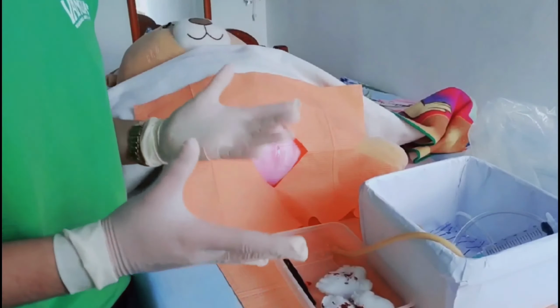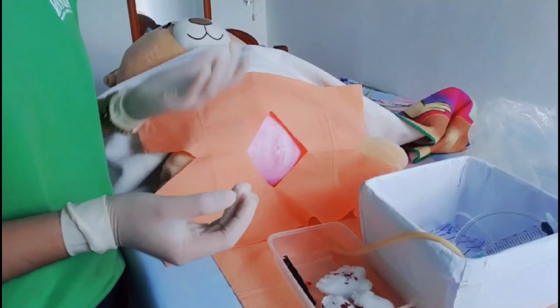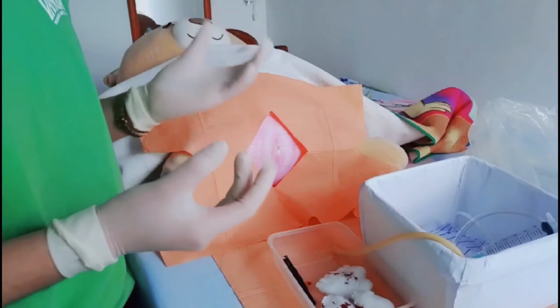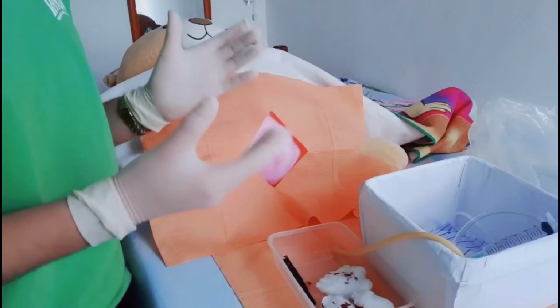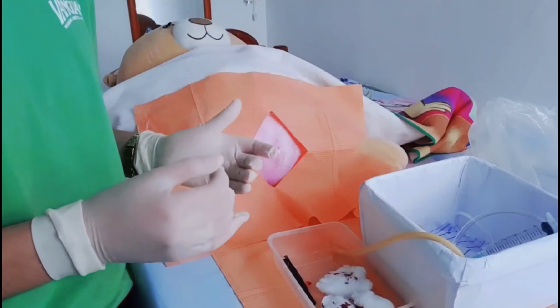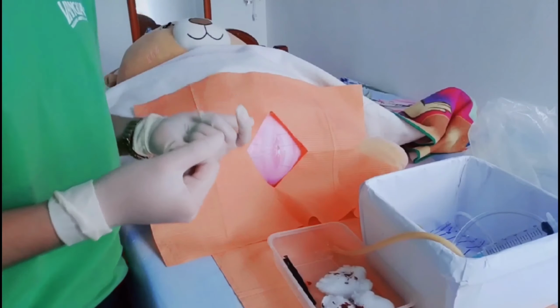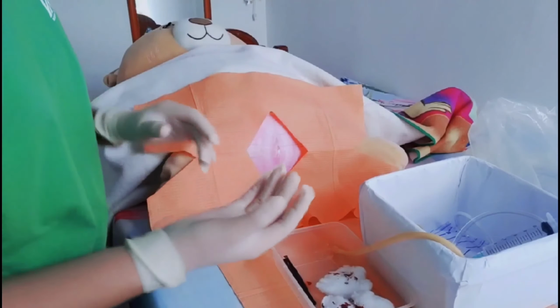With my thumb and one finger of my non-dominant hand, I'm going to spread the labia and identify the meatus. I'm going to maintain the separation of the labia with one hand until the catheter is inserted and urine is flowing well continuously. Separating the area immediately surrounding the meatus helps to make it visible, and allowing the labia to drop back into position may contaminate the area around the meatus as well as the catheter.